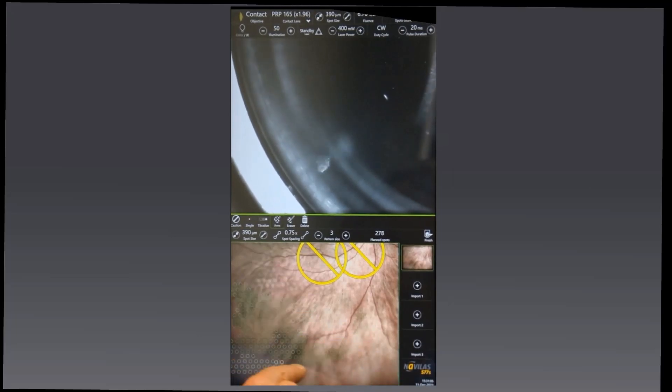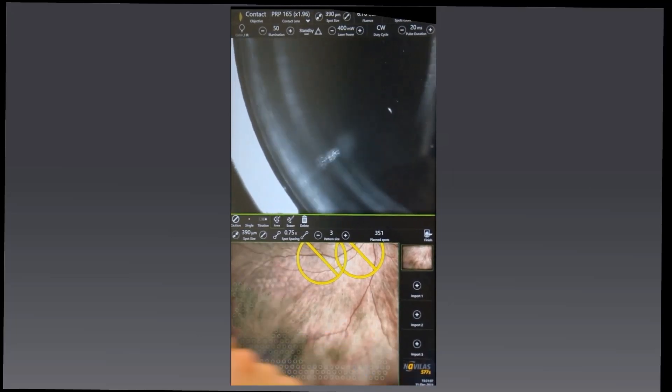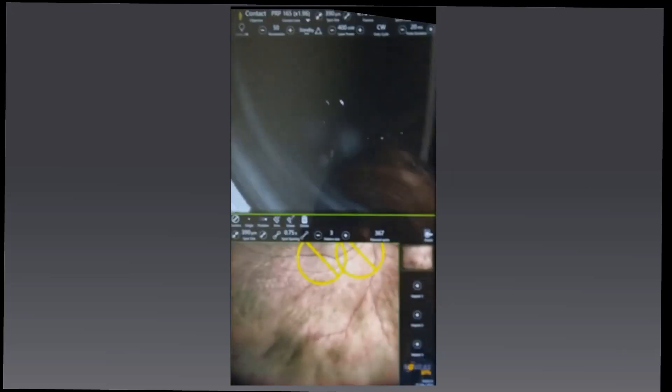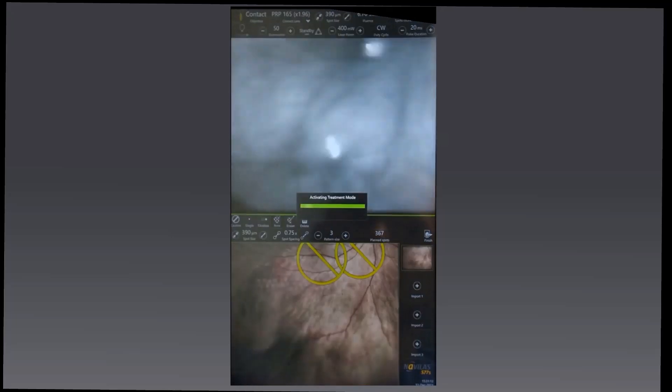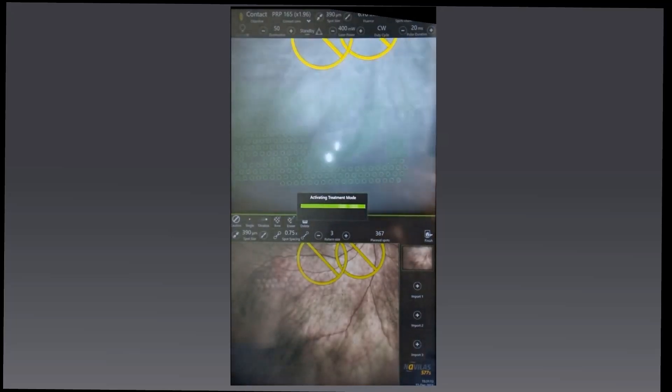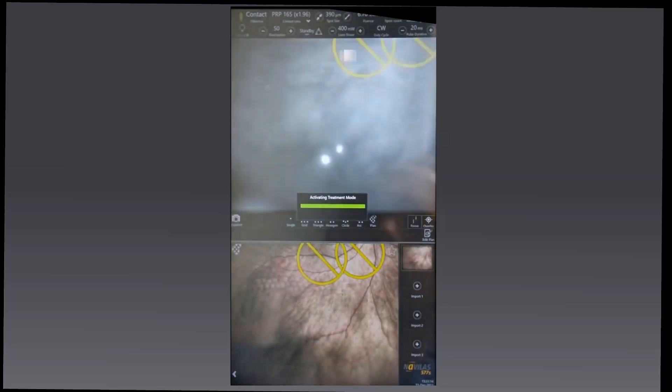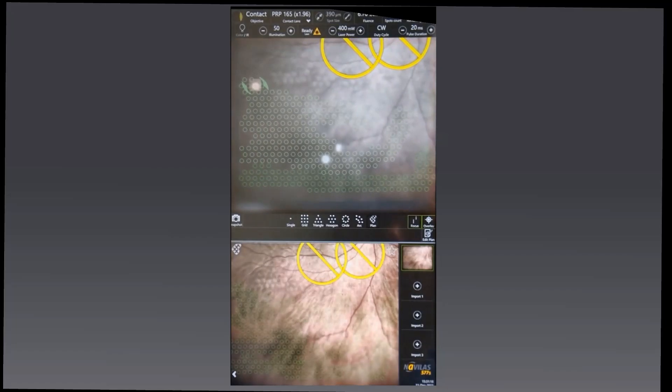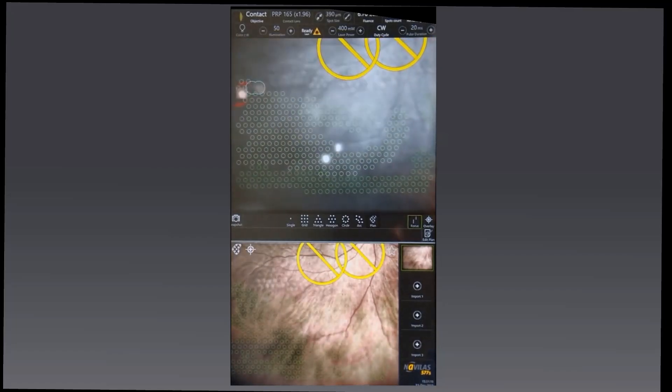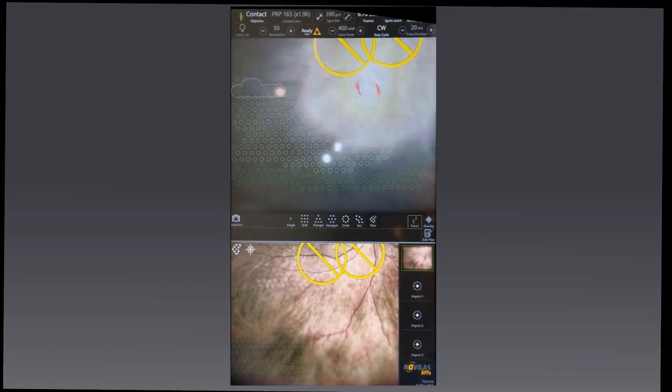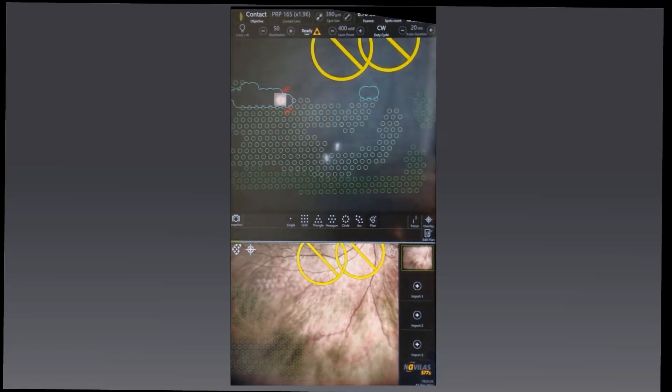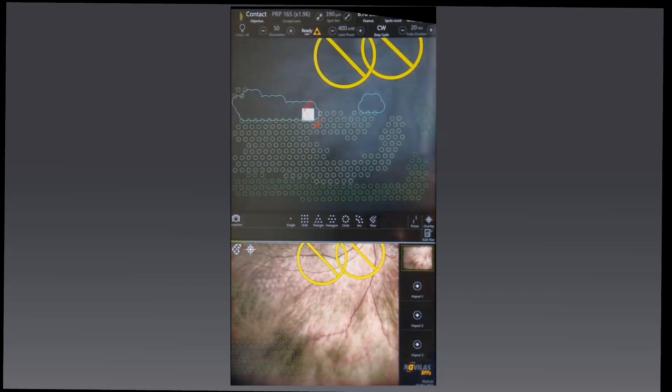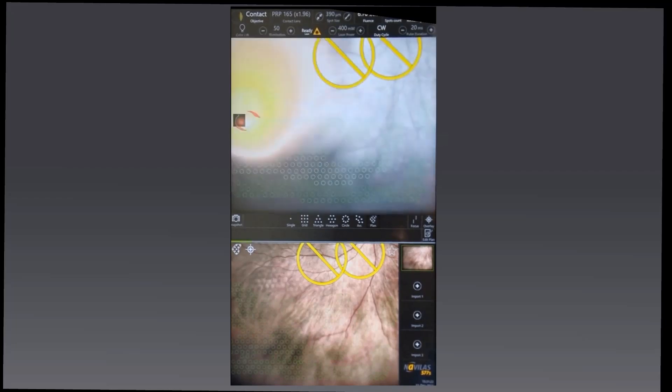As you can see, I'm applying quite a large area of treatment fairly quickly. What's quite noticeable is I'm really not having to pause. The only time I needed to pause was as I went and mapped another area of retina. So I was able to do fairly continuous treatment.